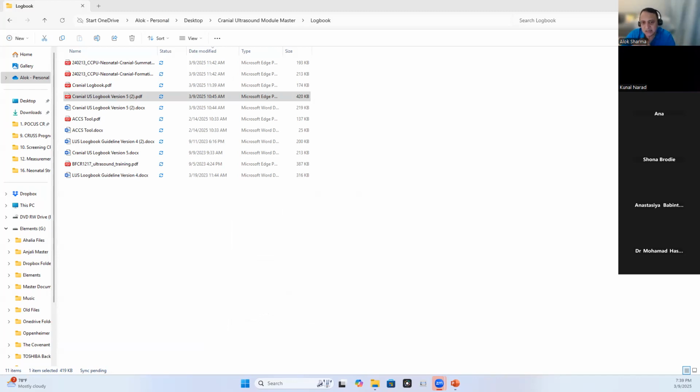Absolutely, fantastic question, and that's why I would say that the expectation is that 50% of your scans are abnormal. But we know that if you work in a level one or a level two center, you're not going to have a lot of extremely preterm babies to scan, to be able to have a lot of IVH or post hemorrhagic hydrocephalus.